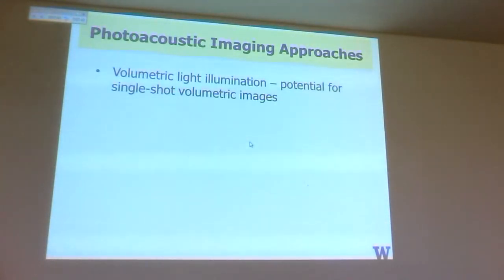So if you hit the surface of the sphere, or the surface of your object, we're physicists, right? So we've got a spherical source, we've got a spherical chicken inside, which we're imaging. All right. So as long as you hit those safety limits at the surface, the best thing you can do is that. The volumetric imaging. And people have built, a number of groups around the world have built variations on that theme based on the specific limitations. Obviously, a mouse is not spherical, but you can do it cylindrically, right? So you have rings in one direction and extension in the other direction, but you can do that.